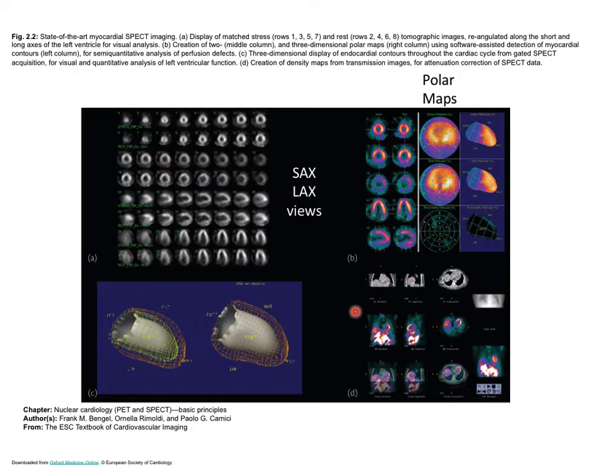And then what you can do is take the CT, now you have a really good anatomical map, and you can map this brightness or perfusion information back into the CT space. So you have high anatomical definition from the CT, and you have perfusion information from the SPECT. The SPECT itself has fairly low spatial resolution, and we'll see why in a minute.